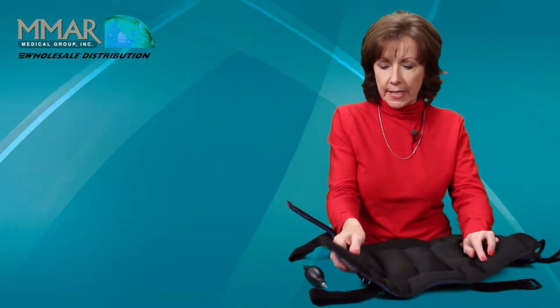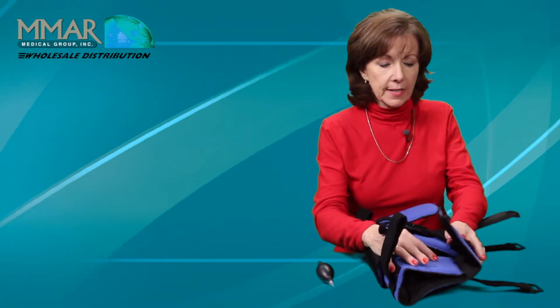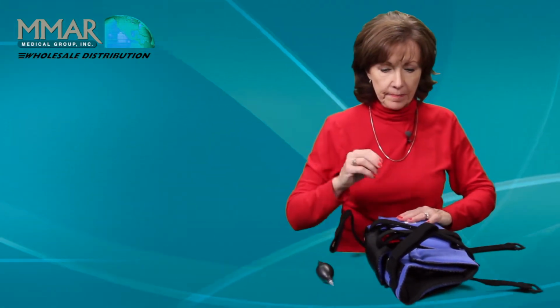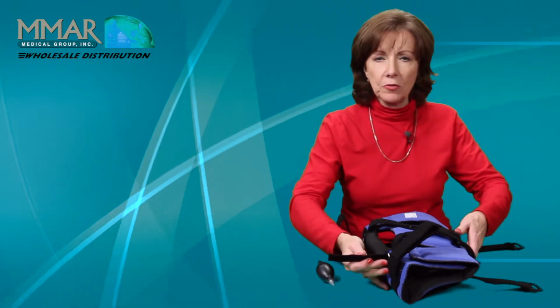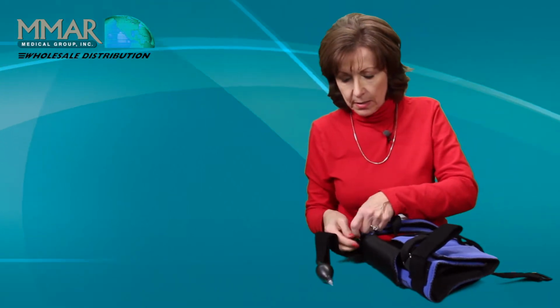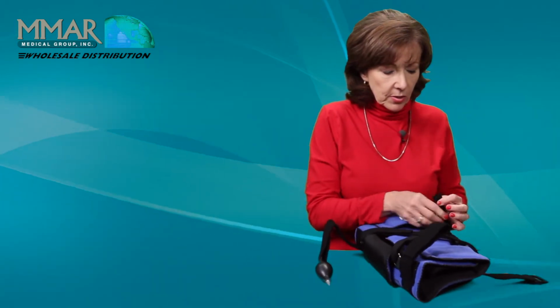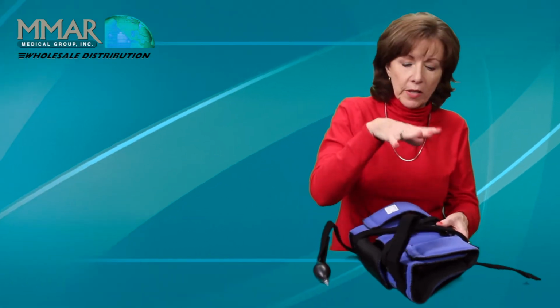So this is how simple it is. You're going to just slide this under your patient's knee, bring it up. Let's attach this and this. And you'll figure out your own way of what you feel like is easiest to put it on. But for the initial fitting, again, we're going to work all 4 straps to get this centered. And you want to suck your leg right down into the device.